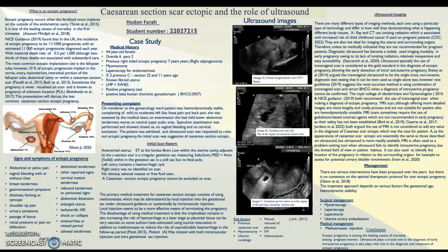When performing an ultrasound scan, it's important that sonographers follow the guidelines and code of practice set out by the Society of Radiographers and the British Medical Ultrasound Society, which covers confidentiality, patient dignity, infection control, safety, ethical and legal and professional issues. Upon meeting the patient, it's important to introduce yourself and inform the patient of your role as a student and gain consent to scan under supervision.